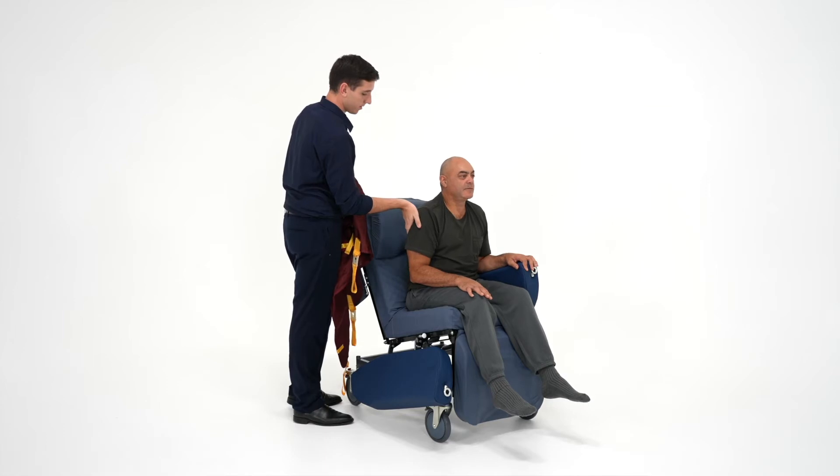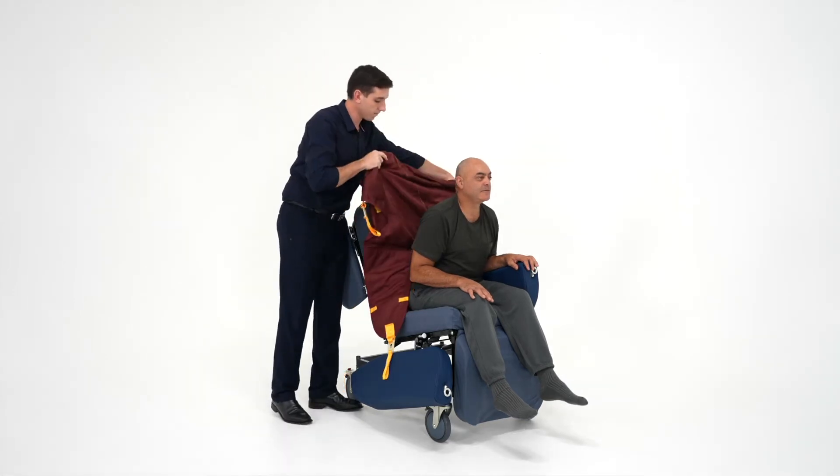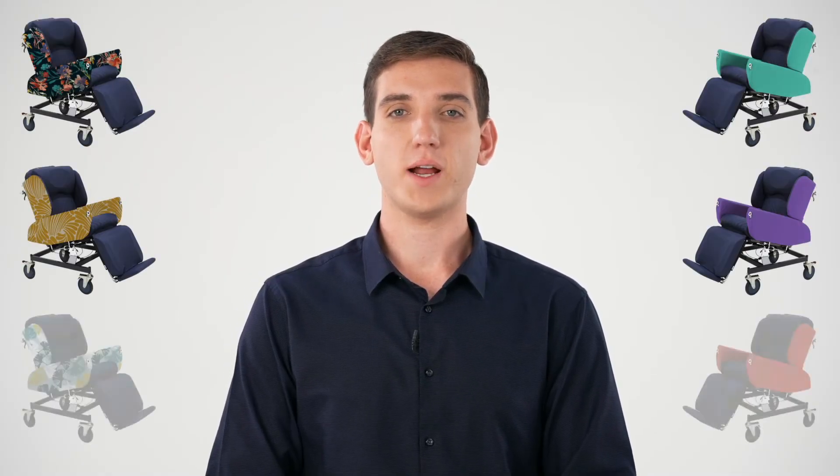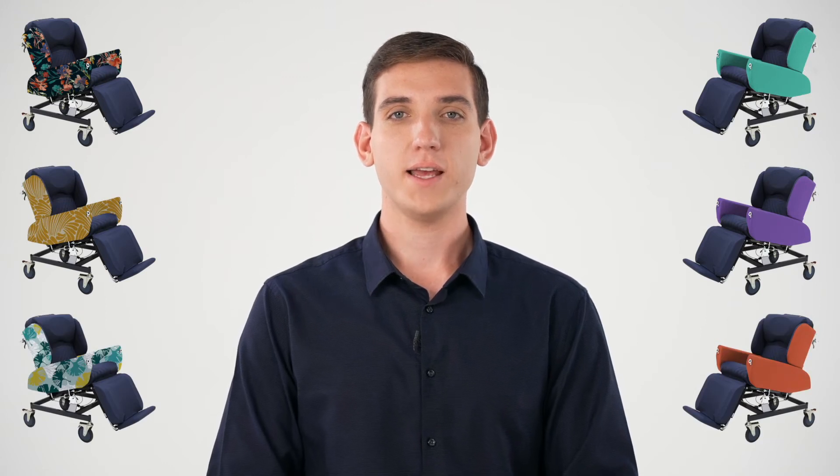From here the chair can be positioned closer to the bed for safer, quicker and more compact transfers. This also allows putting a sling onto the user much easier. Another great thing about the armrests and the wings is that they come in a different range of styles and colours, so you can pick a design to suit your environment.